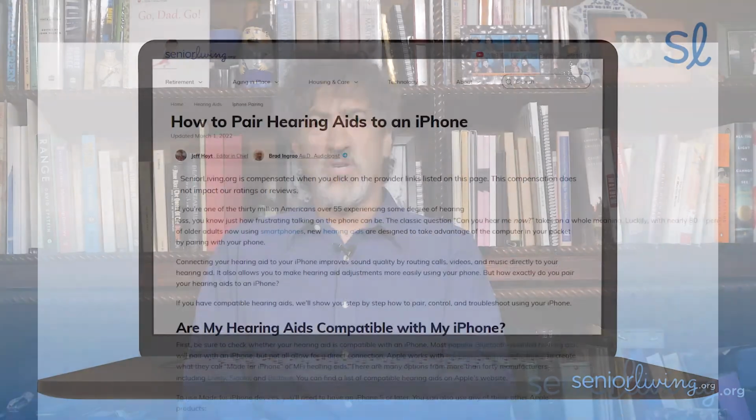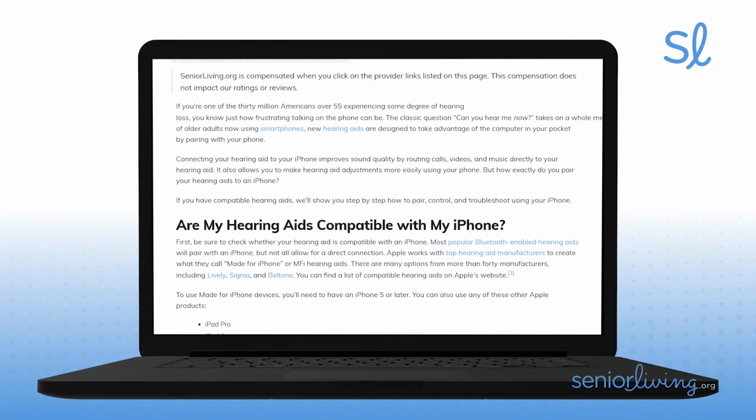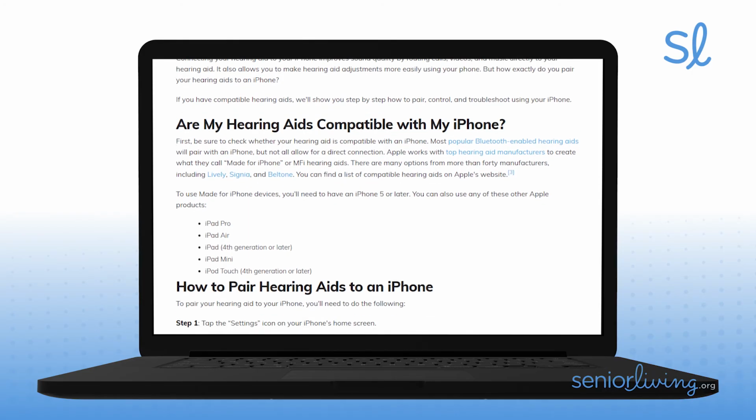With your hearing aids connected to your iPhone, you'll have a much easier time talking and FaceTiming with friends or listening to audio. You'll also be able to use your iPhone to adjust the volume and check your hearing aid batteries. Now, for more details on pairing hearing aids to your iPhone and troubleshooting tips, check out our article.